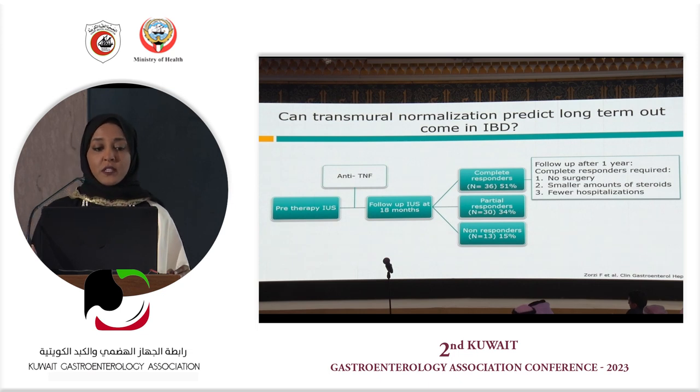So the other question is, if we find the patient in complete remission on ultrasound, would this give us a prediction about the long-term outcome? And can we reach our treat-to-target goals according to the STRIDE recommendations in the long term?